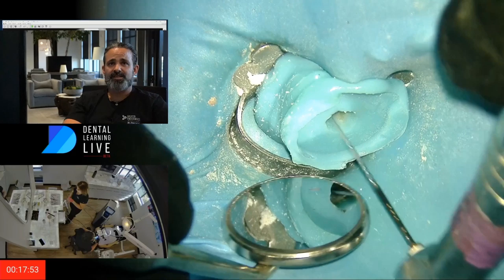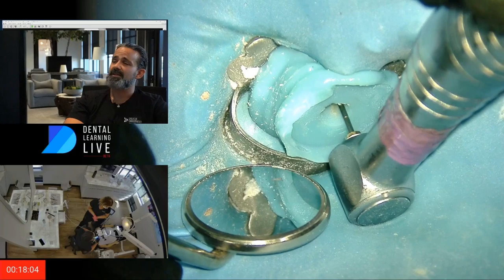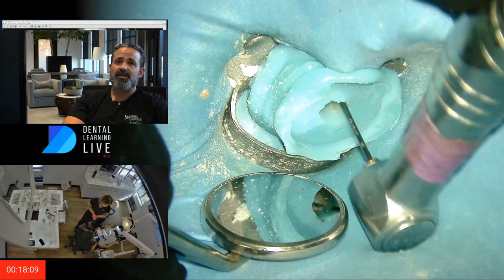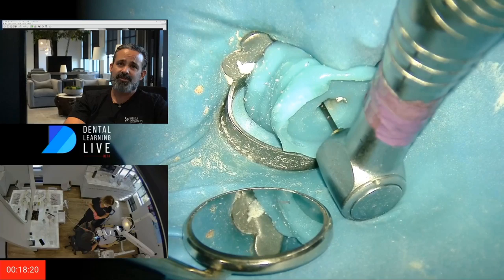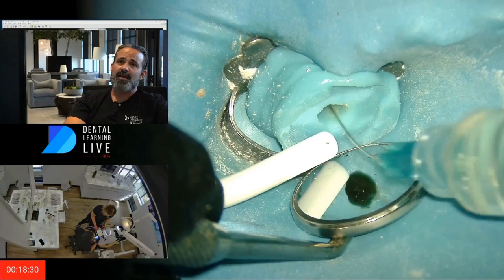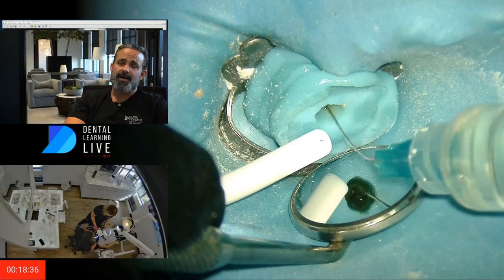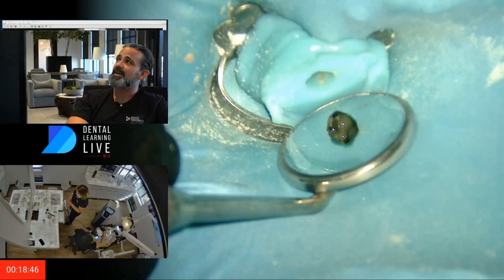I'm going to expose and show those isthmuses in the mesial and distal. That's kind of the positive affirmation when you're doing the GentleWave — seeing those puppies open up, knowing the technology is being employed as you're hoping, meaning the fluid dynamics is doing the job as stated. Without clinical trials and some of the debates going on, all we have is our feedback. But it's very important that we still use what's best in class. With the FDA approving it, I'm going to run it. If I try to go at this with ultrasonics or a rotary file, I'm at risk for strip-perforation, certainly in that mesial. You can't argue against fluid doing its job.